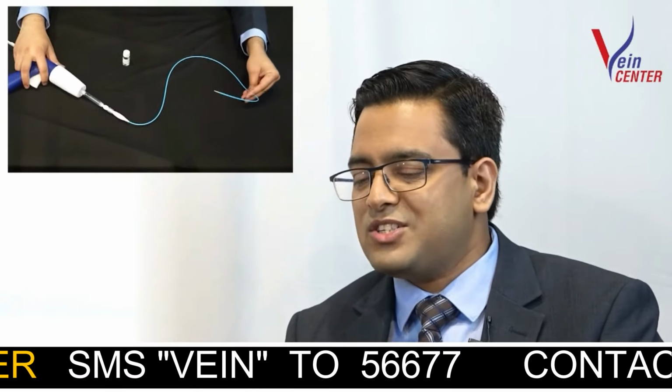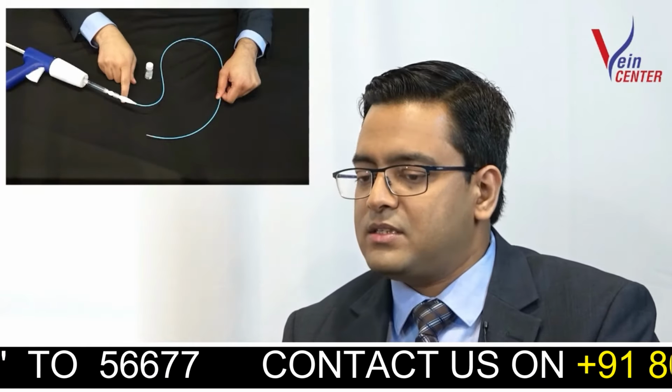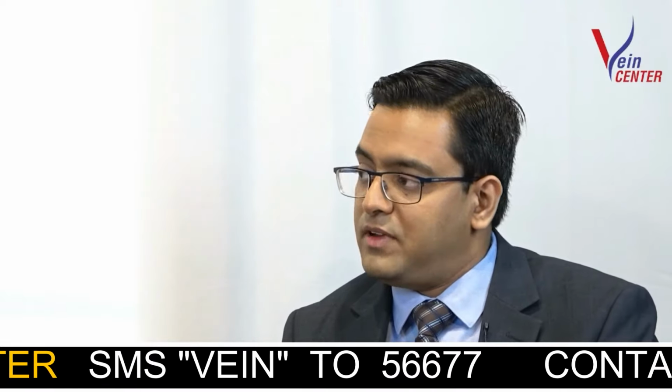Now, because there is no heat involved, we do not need to make the patient unconscious. The patients need not be given spinal anesthesia as well, and we can reduce the fluid load. So in a sense, we are not injecting the fluid which is given to protect from burning, and that has actually helped us to treat much older patients, or patients who are unfit for anesthesia, patients who cannot otherwise be given any sort of invasive treatment.